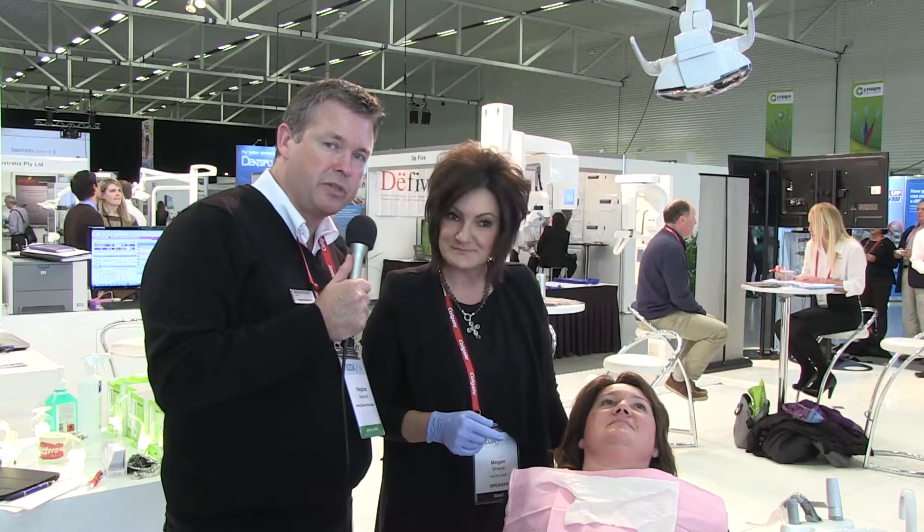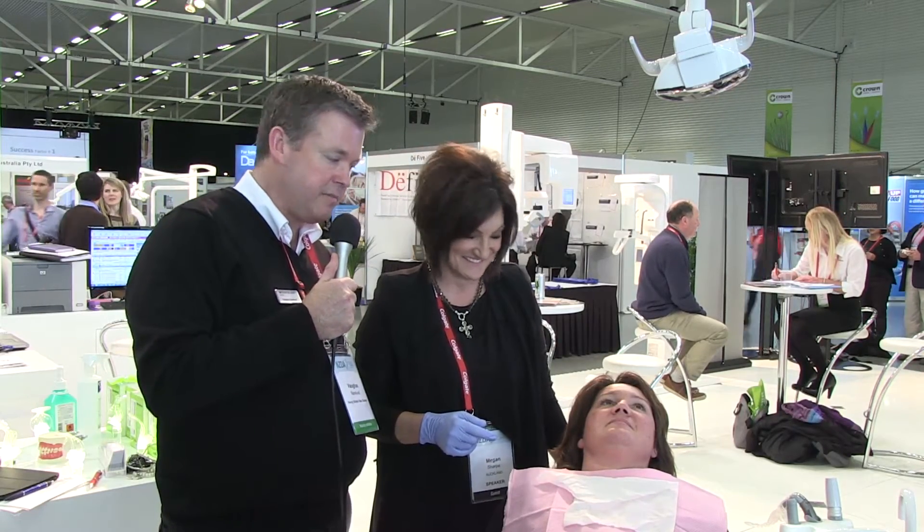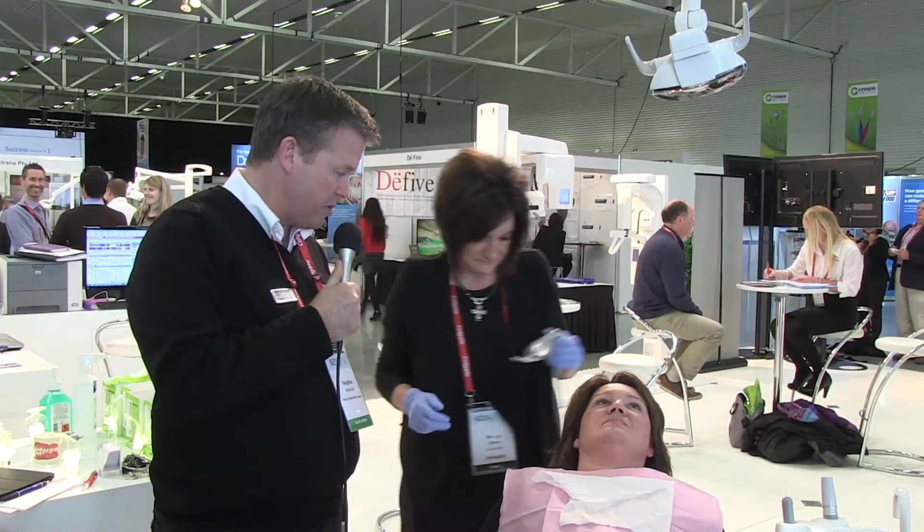Joining me here is Meg Sharp. Meg is our professional services manager, and what we're going to demonstrate today is a new Isolite system. So Meg, why don't you just take us through what this is all about and the sort of impact it's making in the dental community.